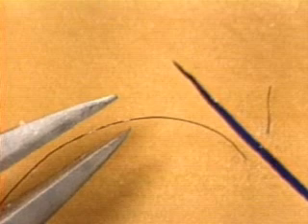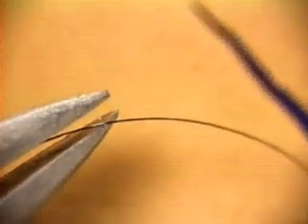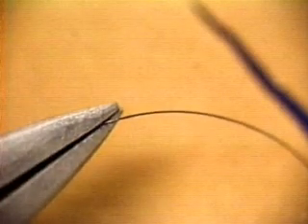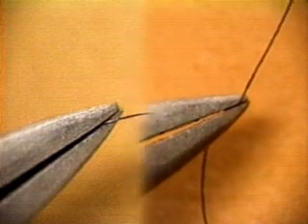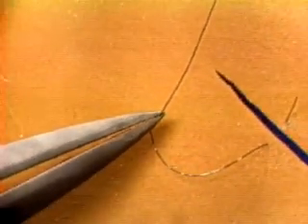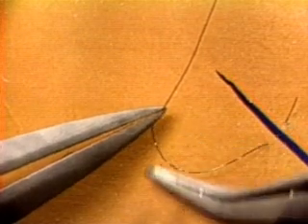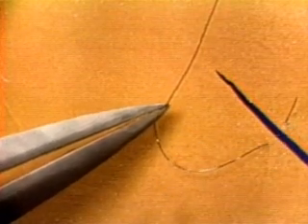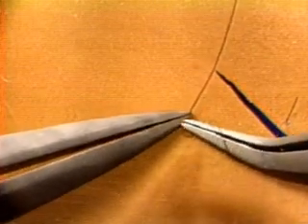Here you are, all ready to pick up the thread, and now I'm going to tell you the first big trick. Watch carefully. Pick the thread up the right way round, like this, not like this. There's a spectacular difference. When you pick it up like this, the thread that's going to be the loop emerges from the side of your forceps which you can't see. That's the side which faces away from where the knot is going to be. The thread which faces that way will strongly resist your efforts to turn it into a loop. If you do make a loop with it, it'll try hard to fall off your forceps.